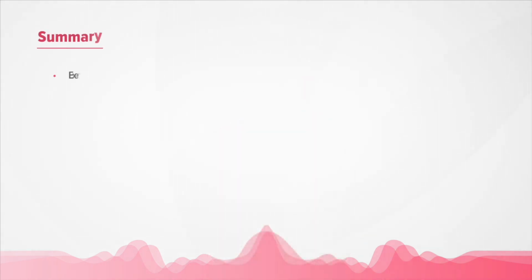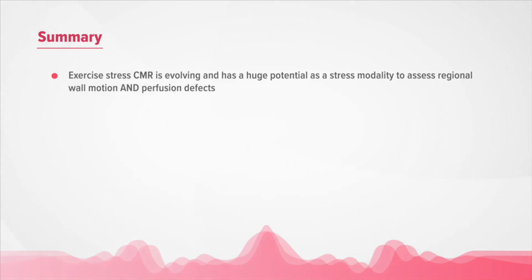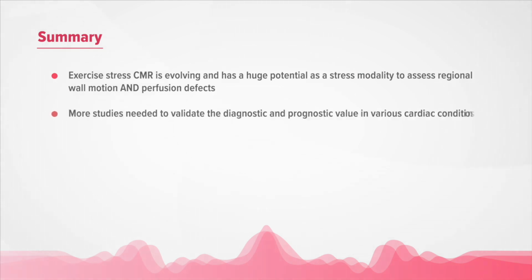In summary, exercise stress CMR is evolving and has a huge potential as a stress modality to assess regional wall motion and perfusion defects using the same modality. Future studies are needed to validate the diagnostic and prognostic value in various cardiovascular conditions.